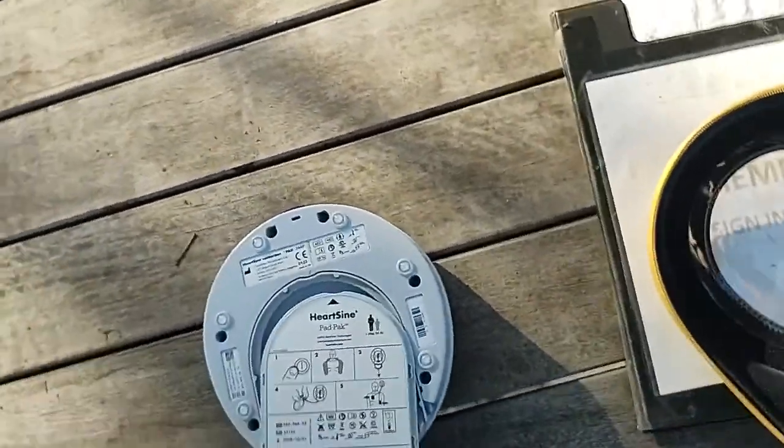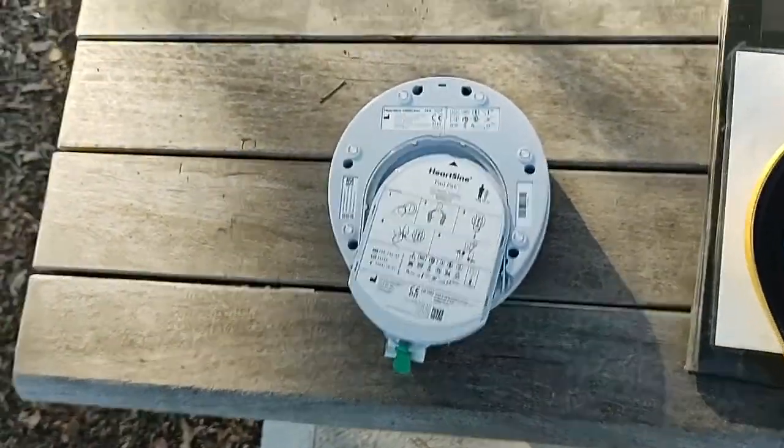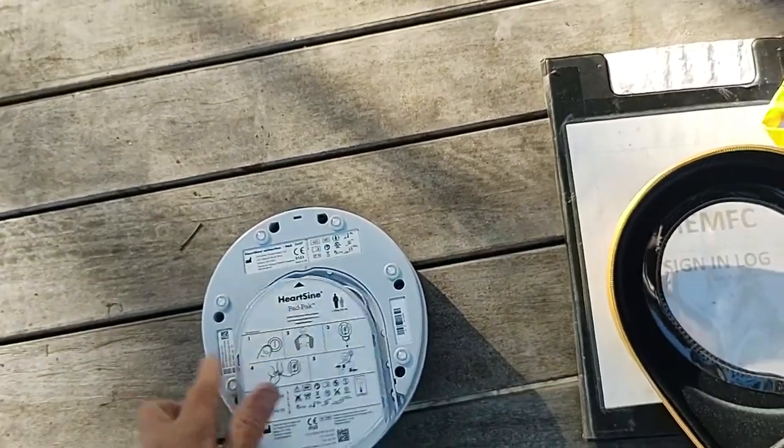That's what we need to do in quite a hurry if someone here has issues with their heart. That's what the defibrillator looks like, and that's what we need to get going for this to work.